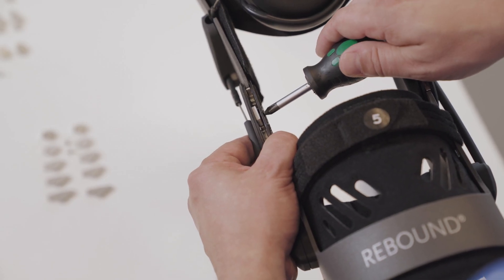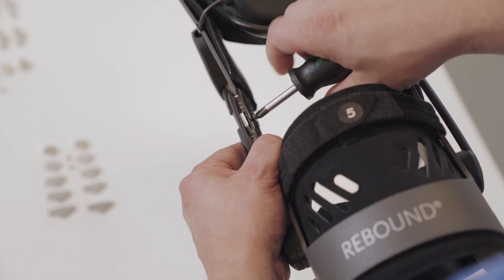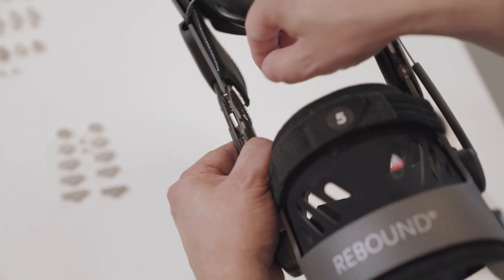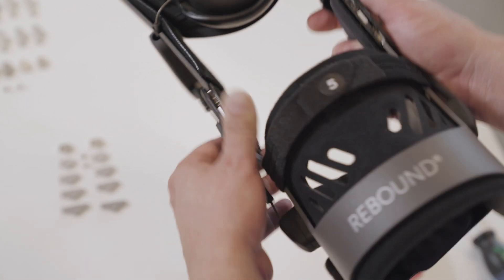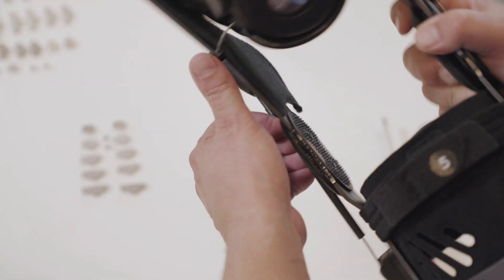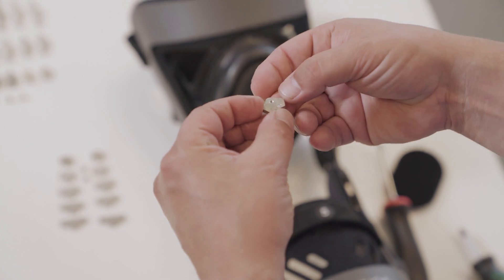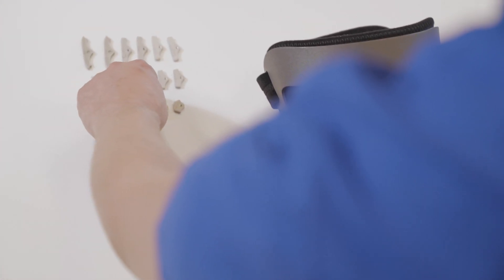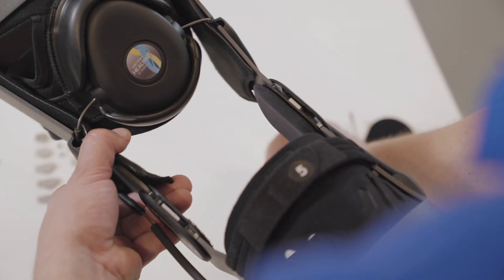Remove the retaining screw with the use of a Phillips screwdriver. Slide the flexion stop out of the hinge. Reapply the desired flexion stop and gently secure it with the retaining screw.